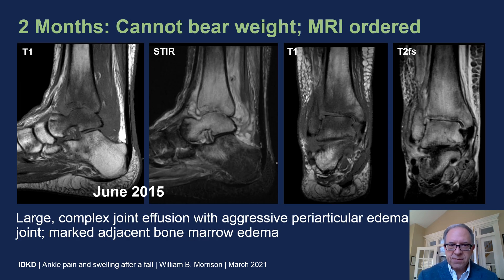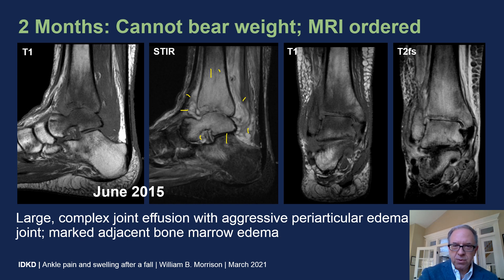Another month passes and she cannot bear weight. An MRI was ordered, and now you can see that there is a large, complex joint effusion. There is diffuse soft tissue edema surrounding the ankle joint, pericapsular edema, and subcutaneous edema. We see tremendous bone marrow edema in the tibia, the talus, and surrounding bones. We also see joint space narrowing and erosions of the central aspect of the joint and at the joint margins.